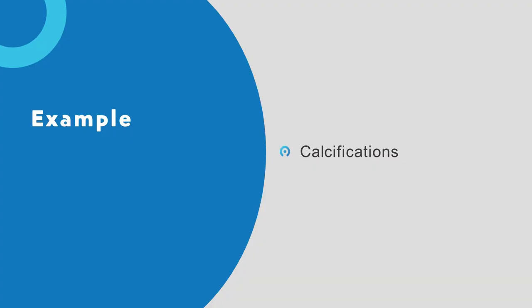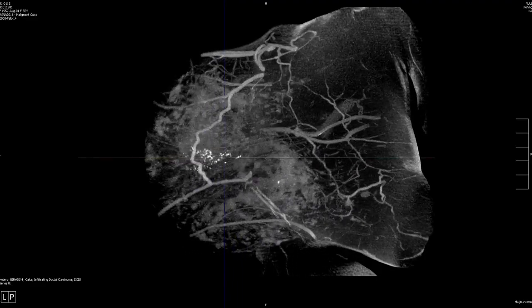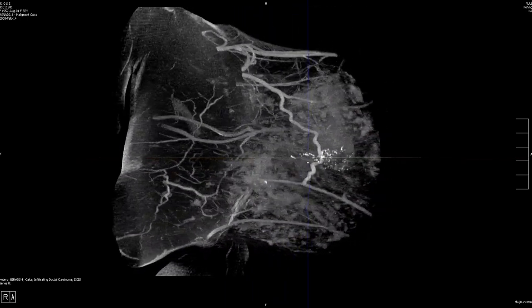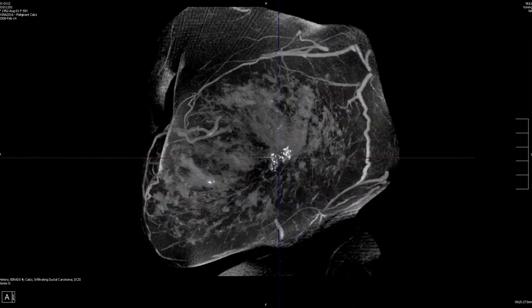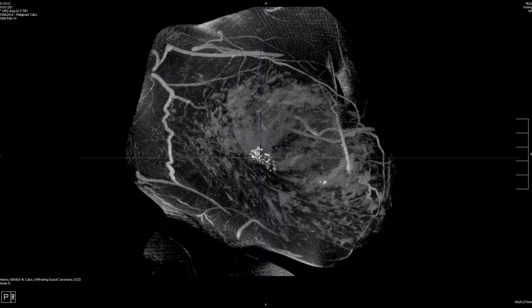Now calcifications. Early on with this technology, two questions arose: CT — too much radiation? And how good is it for calcifications? Because if you're going to use this for screening and you can't see calcifications, you're going to miss a lot of DCIS. Here's an example of a mammogram with pleomorphic calcifications over quite a large area. Then here's what happened on her CT — you can see it clearly, and if you were showing that to the surgeon to plan surgery, it shows you exactly the shape of where it's going. This is without contrast. We can also do localizations with it.